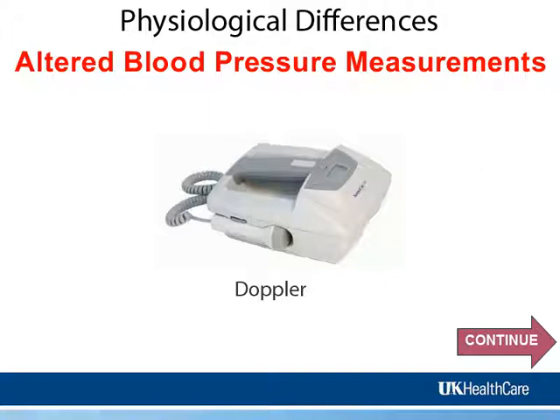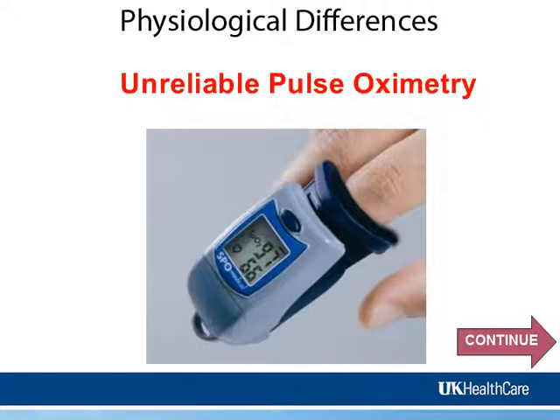Most patients will only have a mean arterial pressure, which sounds like a swooshing sound, that is barely audible near the expected systolic point. Unreliable pulse oximetry. Because of the weak or pulseless condition, pulse oximetry cannot be trusted. One should rely on visual cues. Is the patient pink, warm and dry, or are they short of air? Blue or gray?